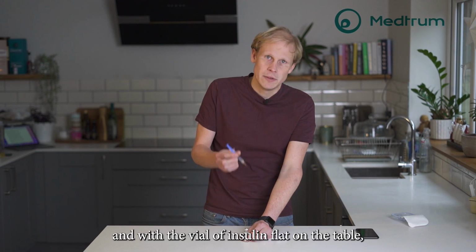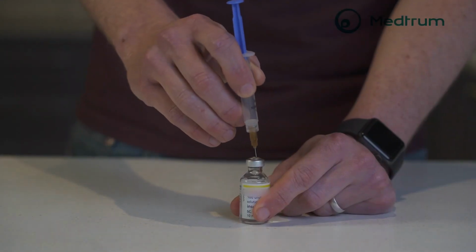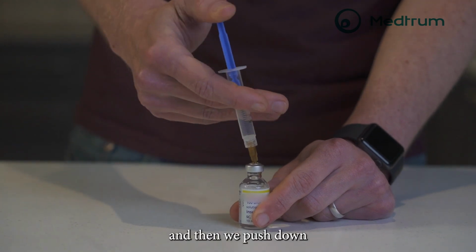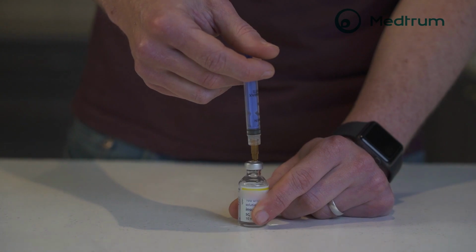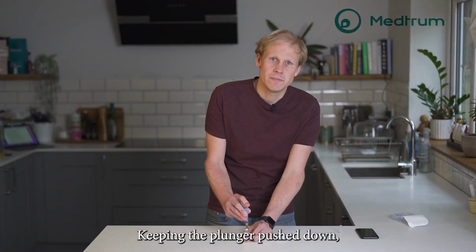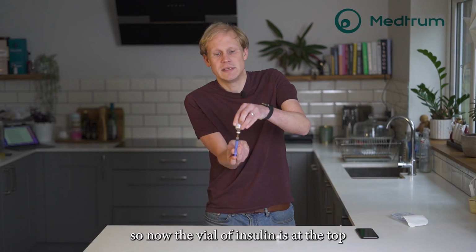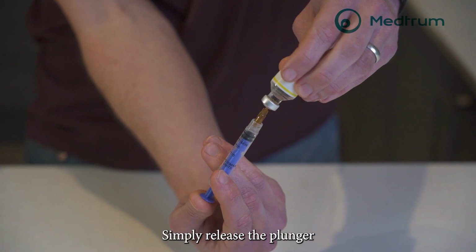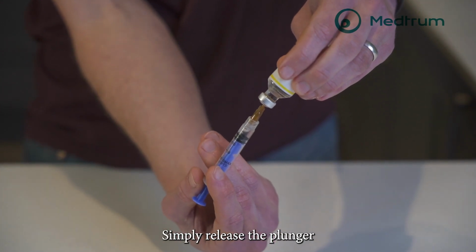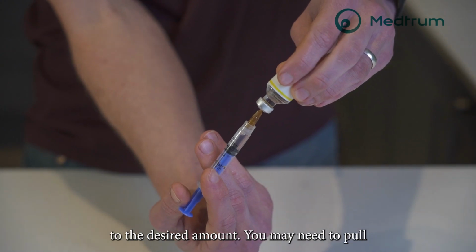on the table, we insert the needle into the top of the vial, and then we push down and push that air into the vial. Keeping the plunger pushed down, turn everything the other way around. So now the vial of insulin is at the top and the needle and syringe are sticking out the bottom. Simply release the plunger and the syringe will fill with insulin to the desired amount.